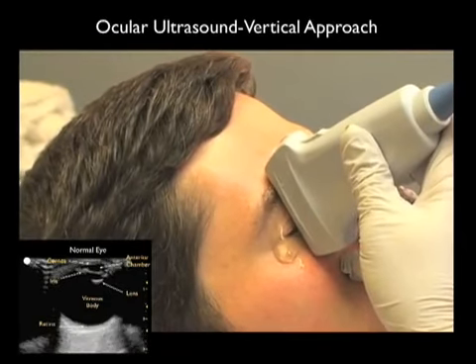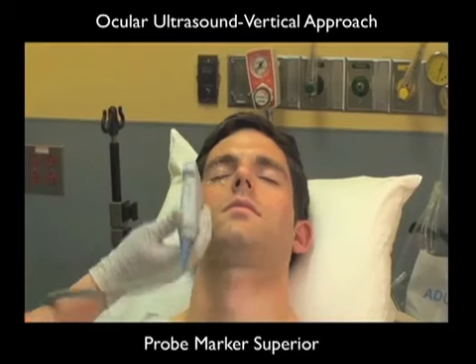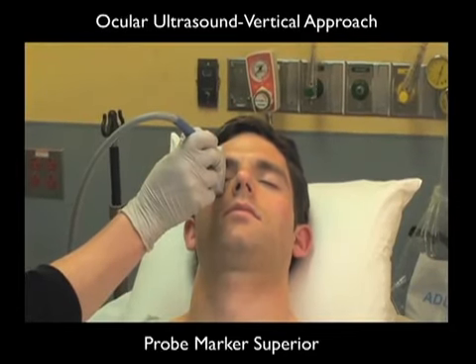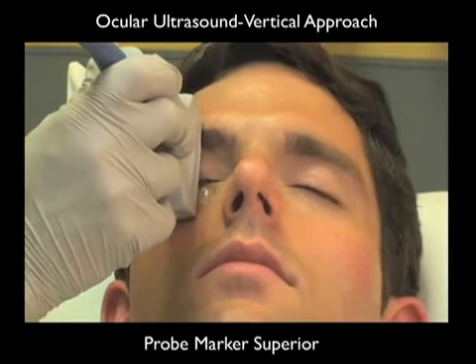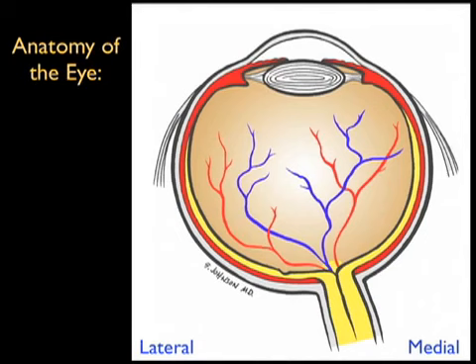And here's just a closed-in view showing the probe placed over the closed eyelid. Here's a more anterior view, again showing the vertical approach to bedside ocular ultrasound. Note the high-frequency probe placed over the closed eyelid, and scanning from side to side will image all parts of the eye. Remember that the probe marker for this vertical approach is going to be oriented superiorly. And imaging in two planes will best round out the examination of the eyeball.